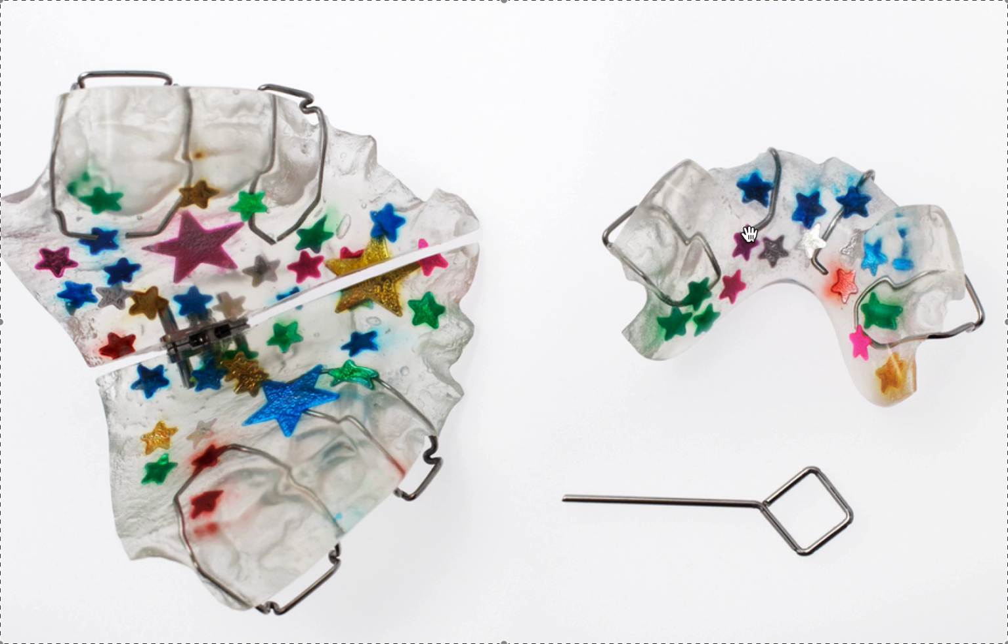Mom, this is only going to work if worn, I say, 24 hours a day. I prefer they actually leave them in while they eat. I mean, obviously a very responsible patient can take them out, put them in the case, brush and put them back in. But more often than not, that doesn't happen.